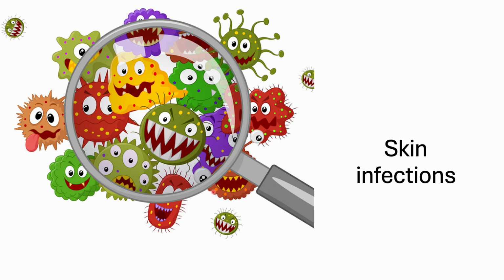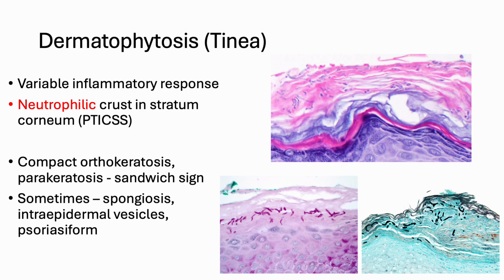In the infection portion, I will focus more on the fungal infection and have a little bit on the parasite as well as the viral infection. The first fungal infection is tinea, which is also the most common type of fungal infection in human skin. From the histologic picture shown here, you can see in the stratum corneum there are many hyphae form of the fungus inside of the stratum corneum, which is also highlighted by the PAS as well as the GMS stain.